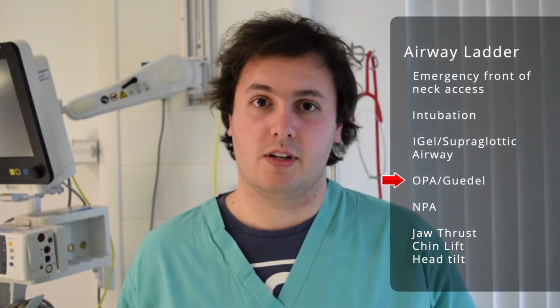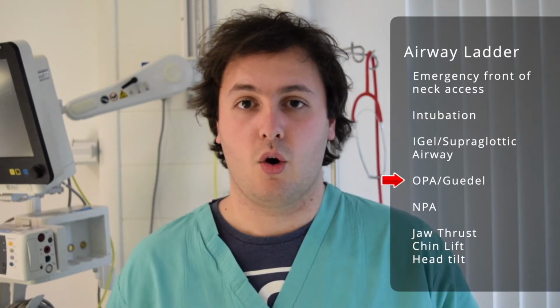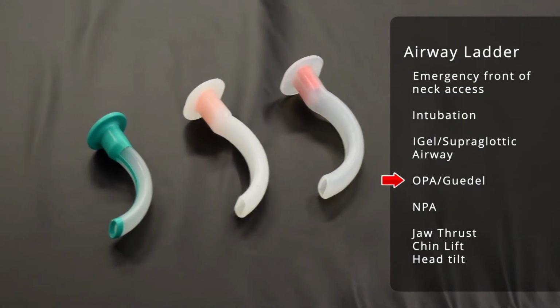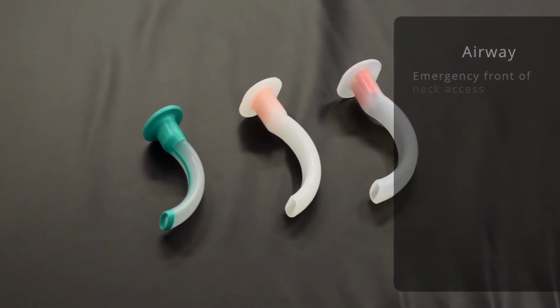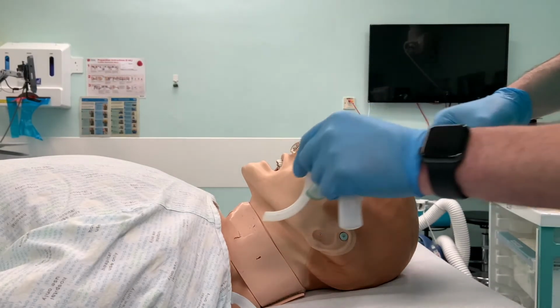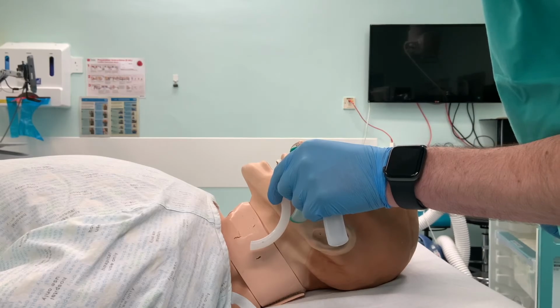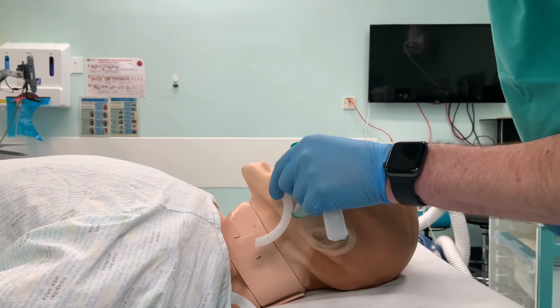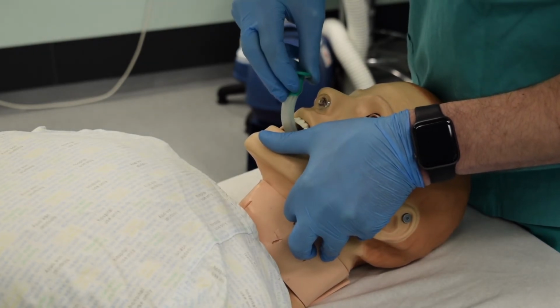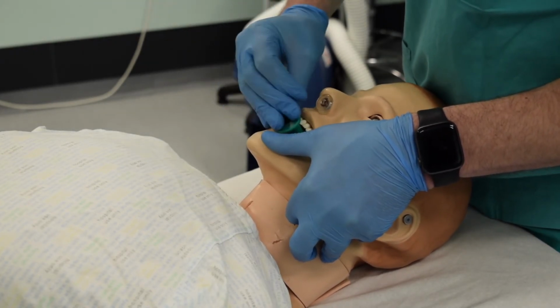If an NPA fails or the patient has a significantly reduced GCS, you might consider using an oropharyngeal or a Guedel airway. These come in multiple sizes and they're plastic and more solid than an NPA and go in through the mouth. They can be sized from the vertical height between the incisors and the angle of the mandible. Once you've sized them, insert them upside down with the curve pointing upwards, and then twist as you insert it so that it passes down to the back of the airway.